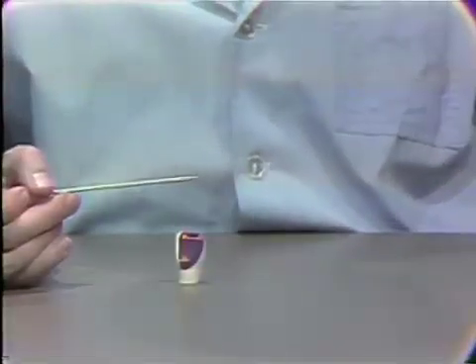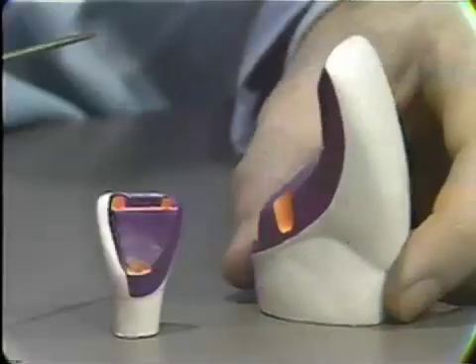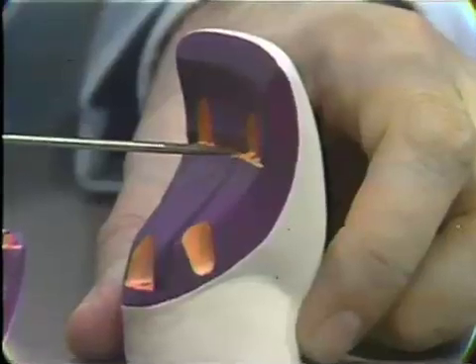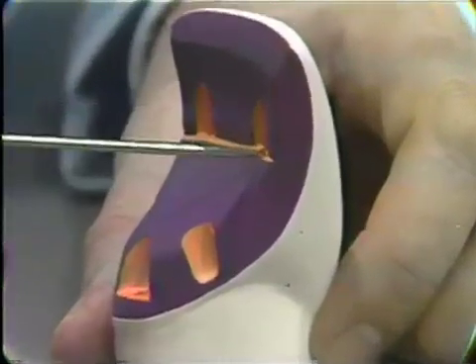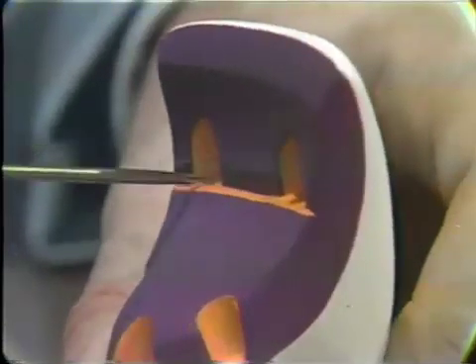A problem arises in these preparations sometimes in the type of incisor tooth which is very thin, with a long, thin incisal edge, and the problem then comes of getting an adequate width to the incisal ledge here, and it's necessary to carry that preparation much further down here in order to get an incisal ledge of the necessary width, so it leads to a somewhat different appearing preparation. Again, you still have the pins, one at either end and one in the cingulum here.